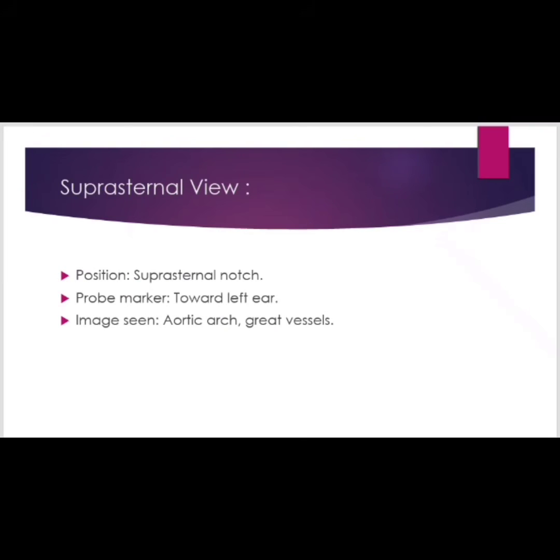Last one is the suprasternal view. I hope you remember the patient position for this. Now we move on to probe position. Place the probe on the suprasternal notch, which is the upper end of the sternum, marker towards the left ear. You can see the aortic arch and great vessels in this.